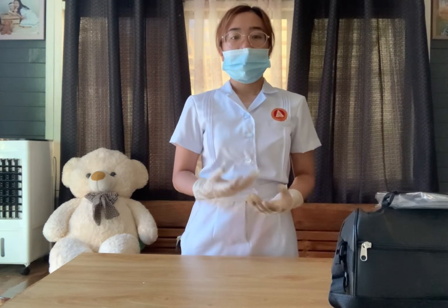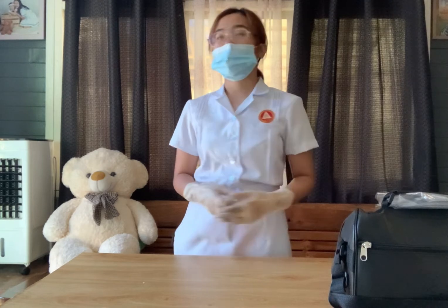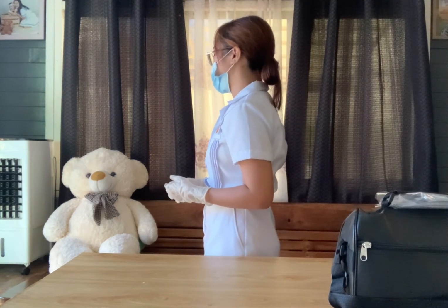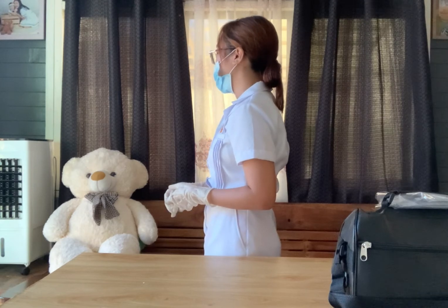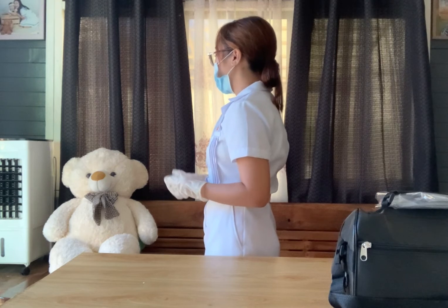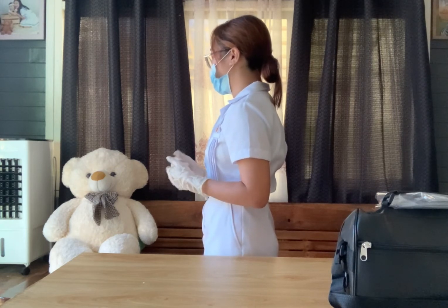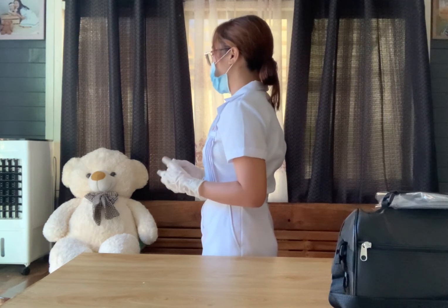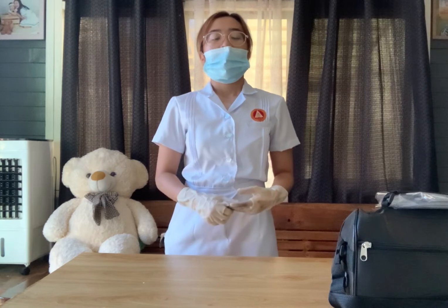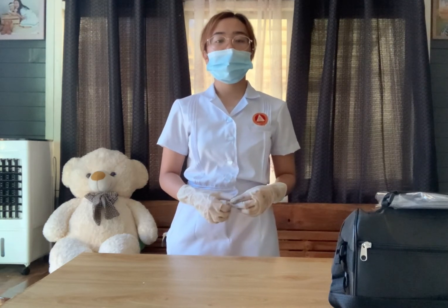For the evaluation, make sure to educate your patient on the result and on the procedure done. Ma'am, we have done the urinalysis using Benedict's solution. For the indicators, your urine shows a brick red color, which indicates the possibility that you have glucose in your urine. That ends the urinalysis using Benedict's solution test.